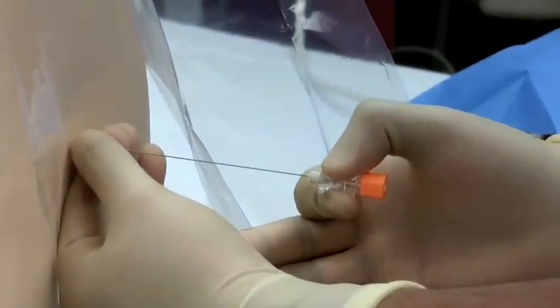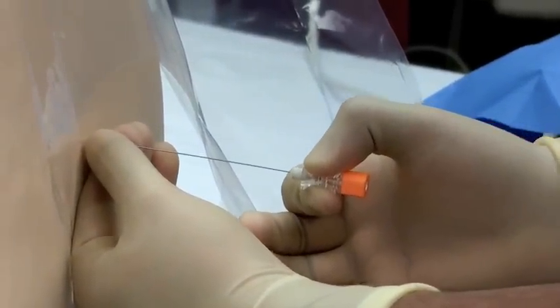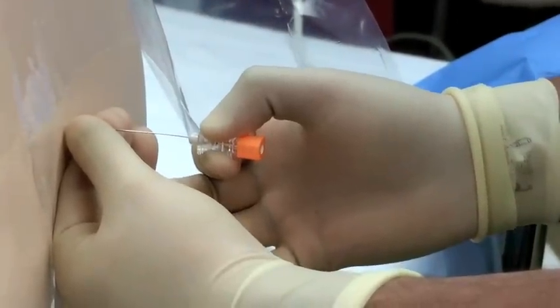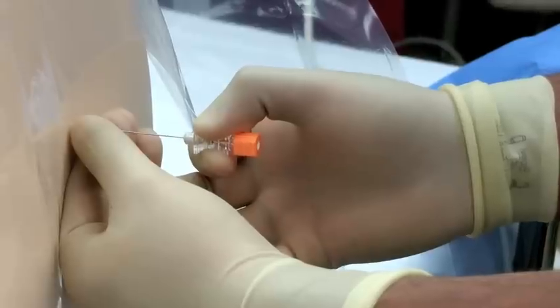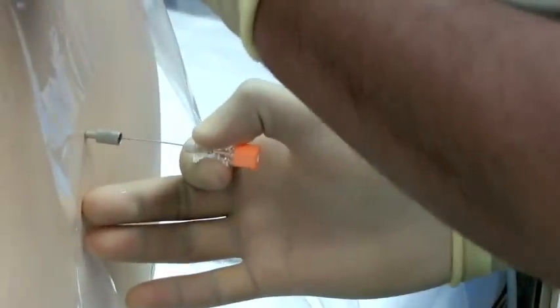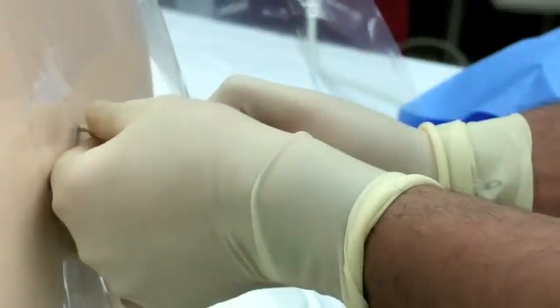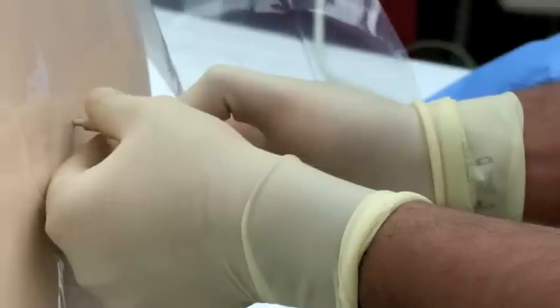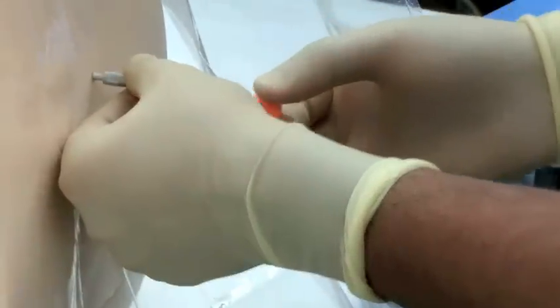I'm going to place my spinal needle through the introducer needle and advance till I feel a popping sensation. Withdraw the stylet each time you feel a pop to assess for CSF flow. Feel a pop.